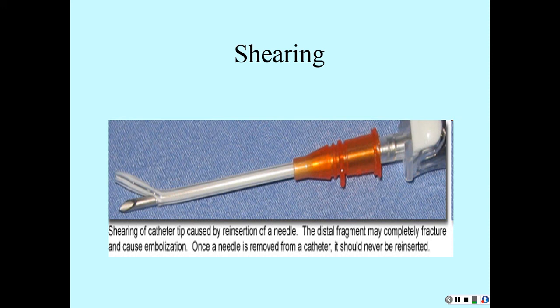You turn them on their left side because it allows air to enter into the right atrium and disperse through the pulmonary artery. That is if you're not coding your patient. You may be coding your patient.